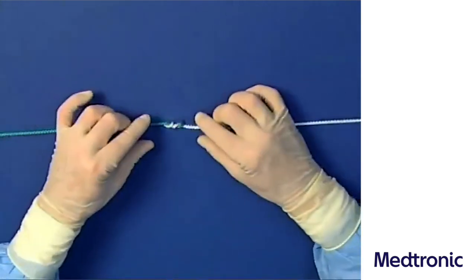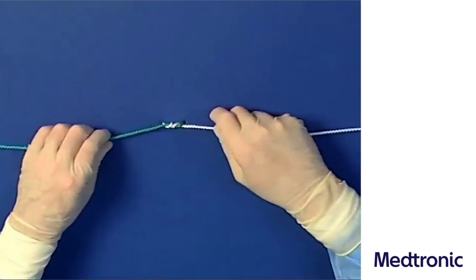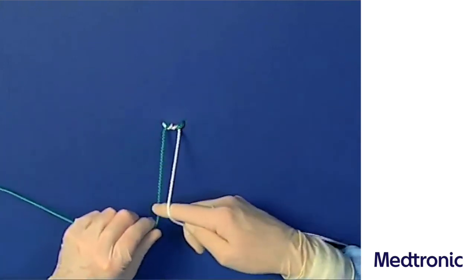The other two alternatives are performed with the right or left hand using the index finger technique.